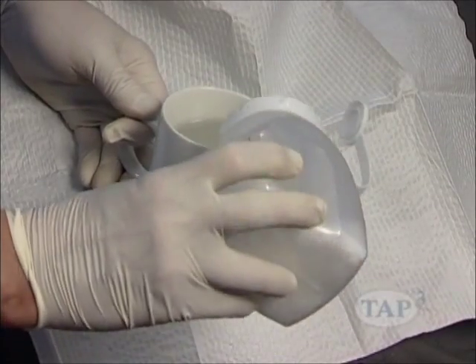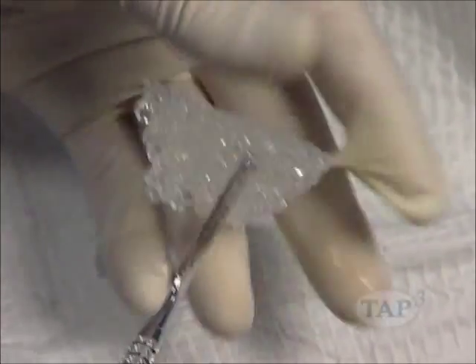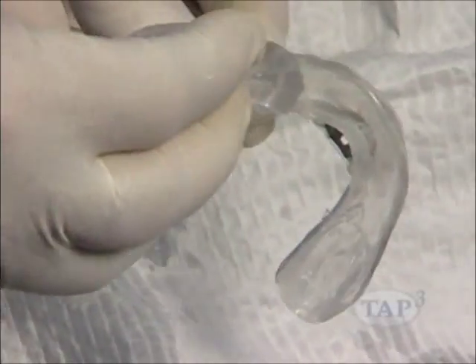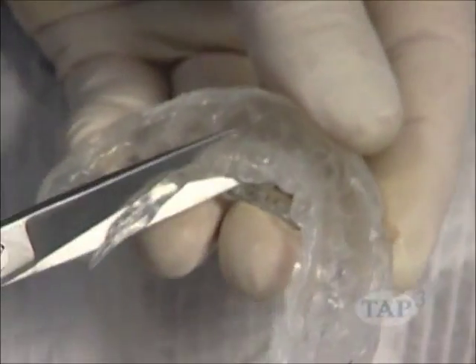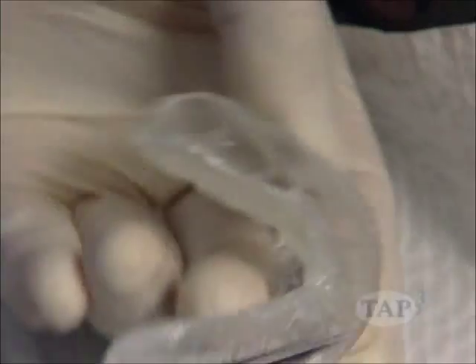Place the thermocryl beads in hot water and heat until the beads coagulate and become clear. Wet your fingers and roll the thermocryl into a rope. Fill the tray completely to the top with the thermocryl. Have the patient place the tray in their mouth and press it into place. Then, have the patient remove it. Trim any excess thermocryl that expressed out of the tray as explained in the Fitting the Tap Thermocryl segment.